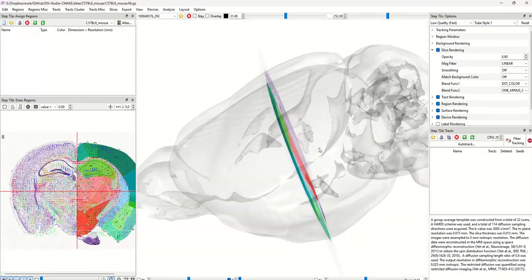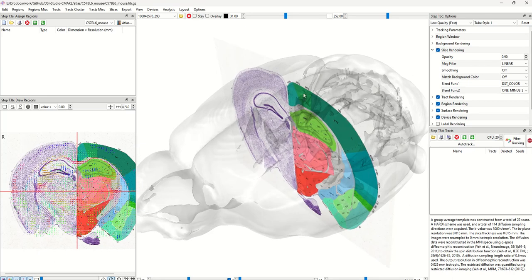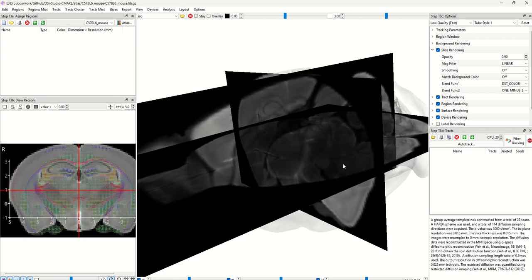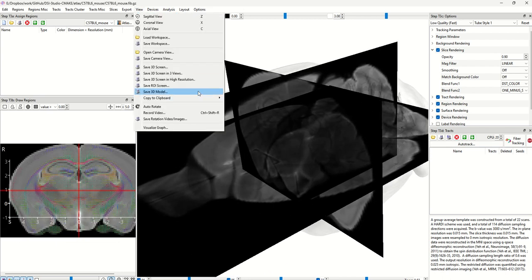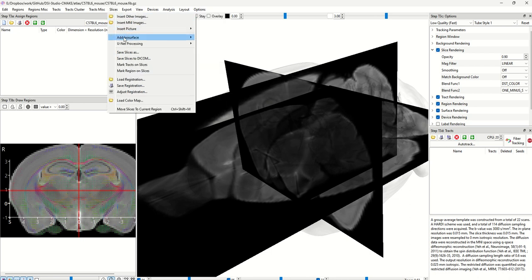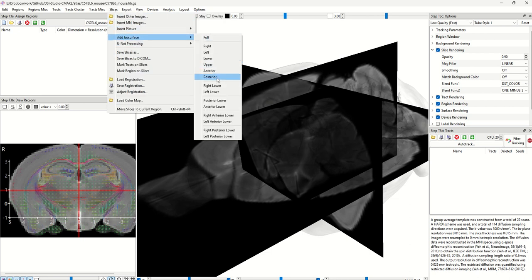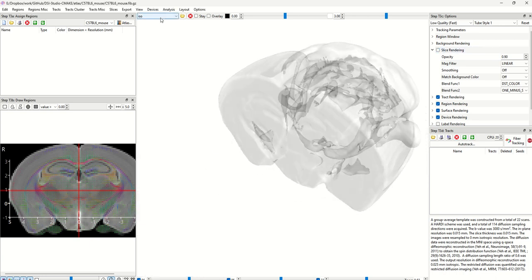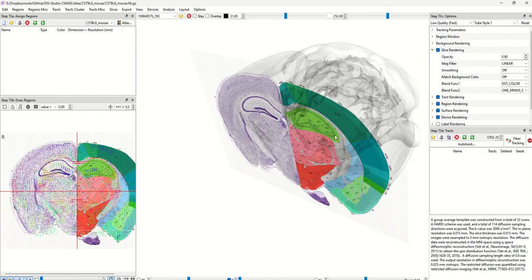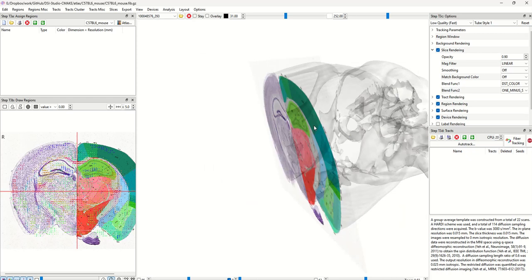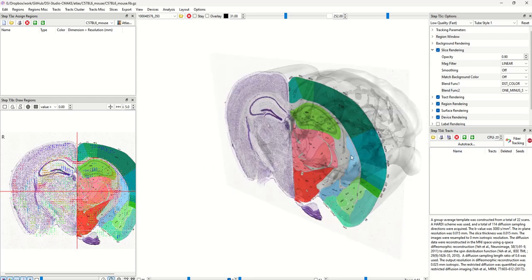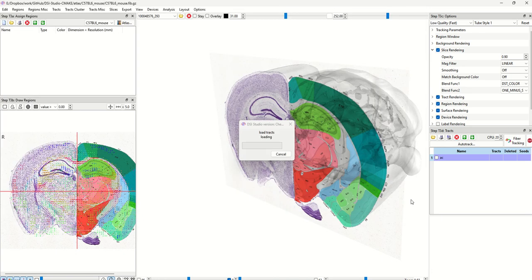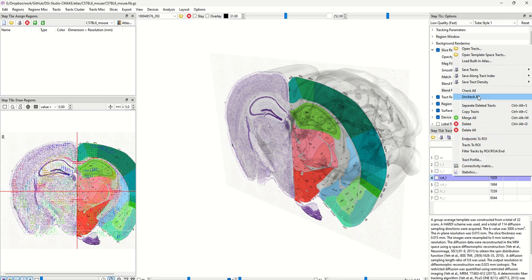Another tip is to create an ISO surface just posterior to the slice. Switch back to the ISO option, go to the Slices menu, and add ISO surface to the posterior — click the threshold and click OK. You'll see it adding only on the posterior part. Switch back to the histology slide and enable slice rendering. To visualize everything together with tractography, there are several ways to generate tracks; to keep it simple, just open existing tracks and load all of them.